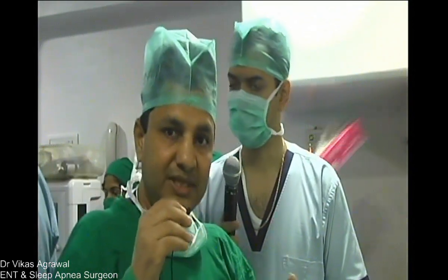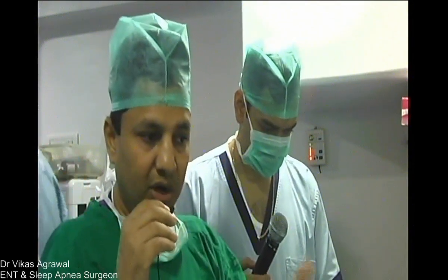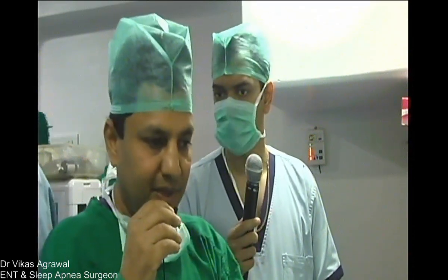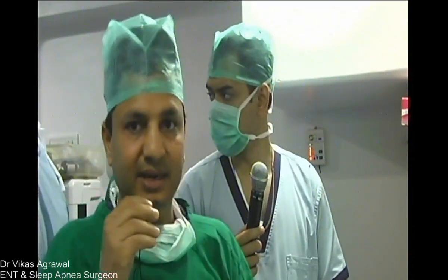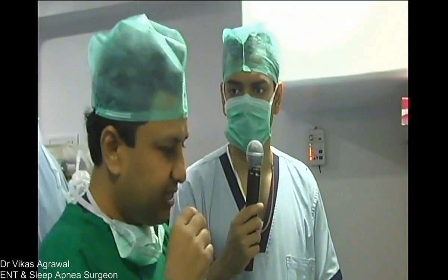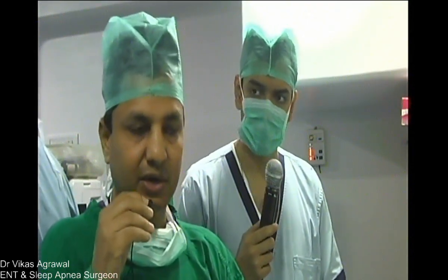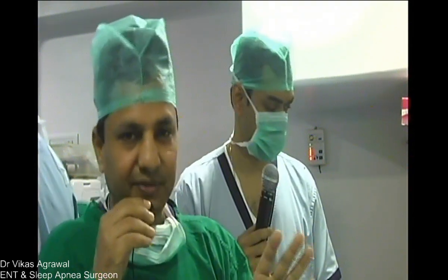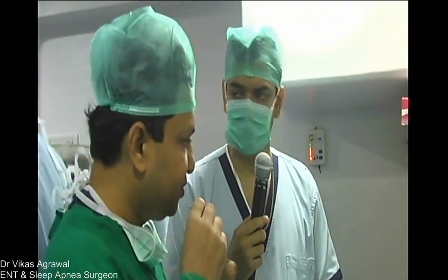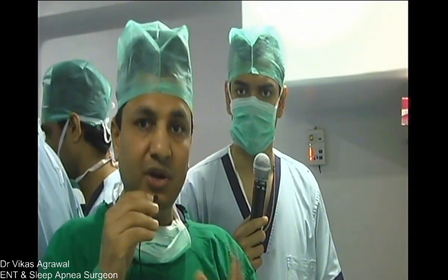Why should you take the risk of anesthesia, surgery, bleeding, pain, everything? Absolutely. Once we know that the patient is not happy with CPAP, is unable to use CPAP, or in cases where we know that there is a big base tongue collapse like this. This patient also has tried CPAP for almost 2 months and is unable to use it. You can understand that the CPAP closes the epiglottis further like a lid, because the base tongue is falling and the CPAP air is further closing it like a lid. So especially the base tongue and epiglottis cases, which are almost 20-25% of all the cases, would generally not tolerate CPAP. It's not a question of compliance. It's a question of efficacy. So CPAP is not effective on them.